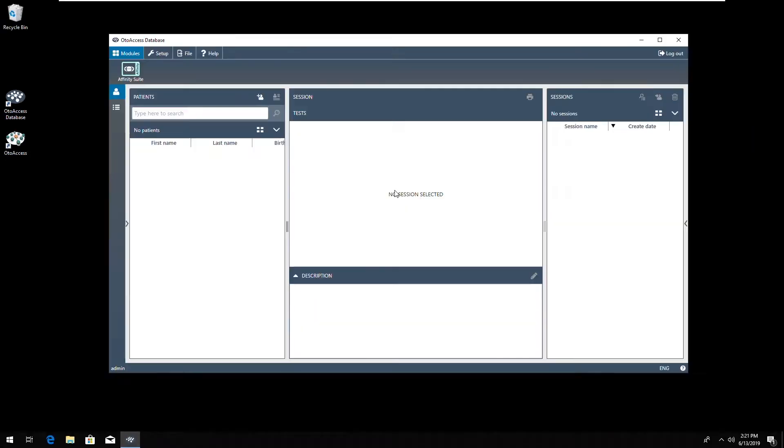And we have a new, completely empty AutoAccess database installation of the new version, where we have no patients and no sessions.